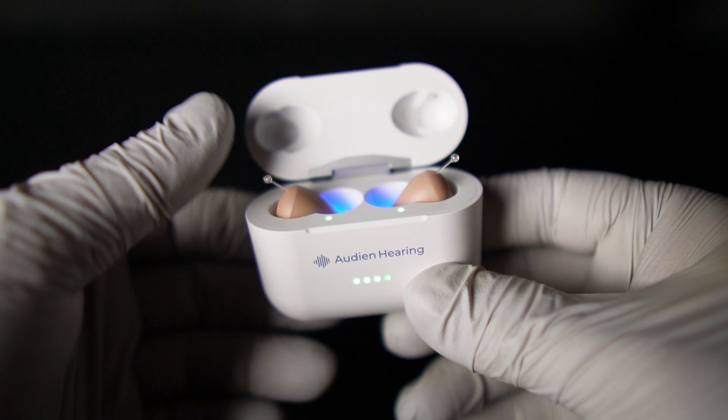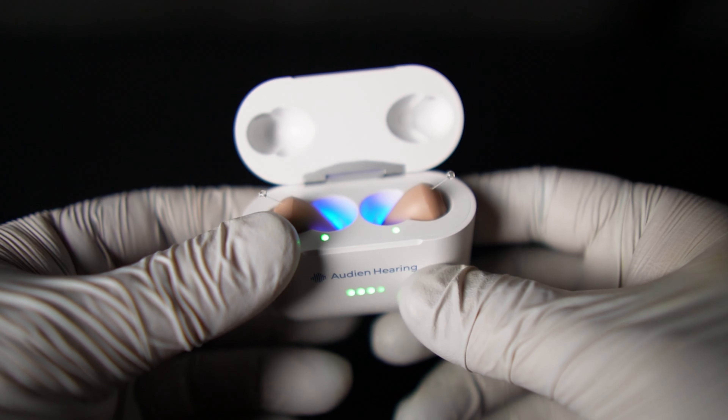These are some of the smallest over-the-counter hearing aids you're going to find on the market right now. They are ITC style hearing aids, which stands for in the canal. Very small, very discreet, rechargeable, and also very affordable.